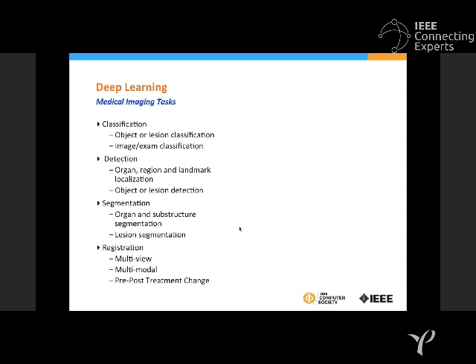And last but not least, we require good visualization, because the users of this outcome are not the computer engineers or the machine learning people. They are mostly the doctors, the radiologists, or maybe the patients or other agencies. So you need good visualization so that the doctors can save time and get a good inference based on the analysis that has been done.